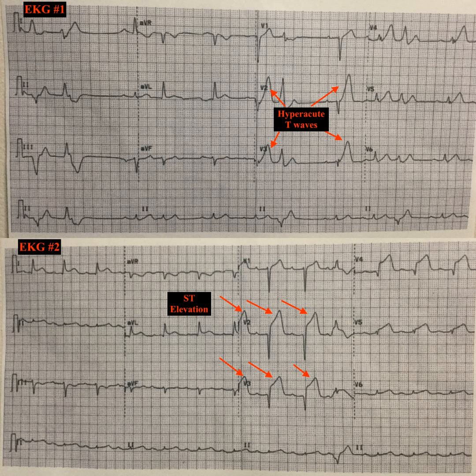And this shows a large anteroseptal myocardial infarction with ST elevation, 6 boxes, 7 boxes in the precordial leads, and some changes in AVL because it's a very proximal LAD. Based on the cath, it got the diagonal branches that come off the LAD, so they got some of the lateral EKG leads there.